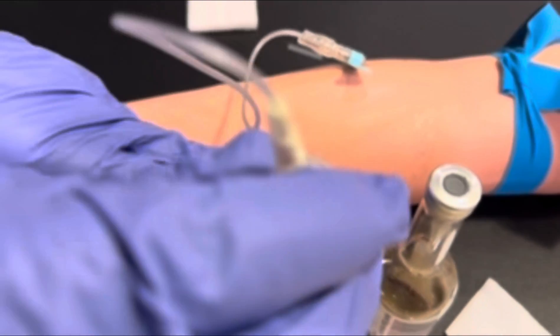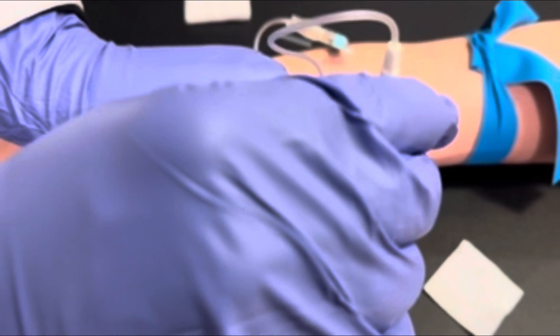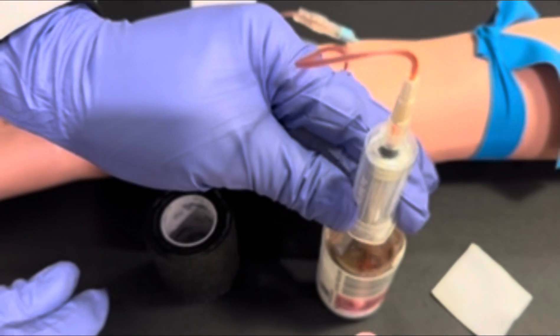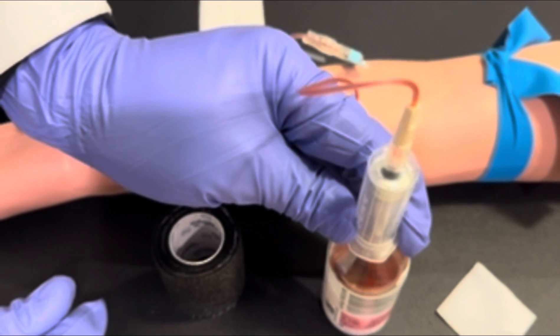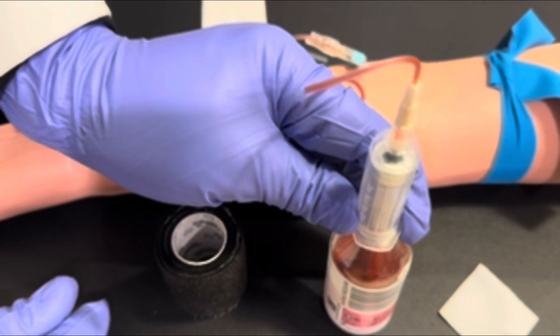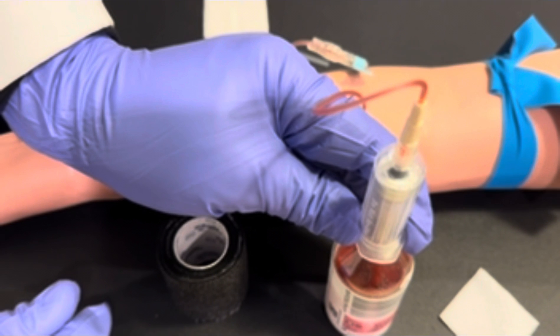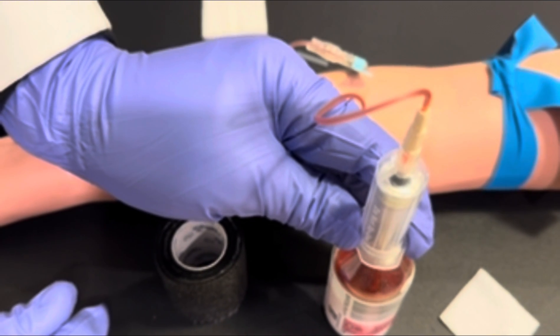Watch for the backflash. And then attach the vacutainer holder to the neck of the blood culture bottle and allow the blood to flow into the blood culture bottle.